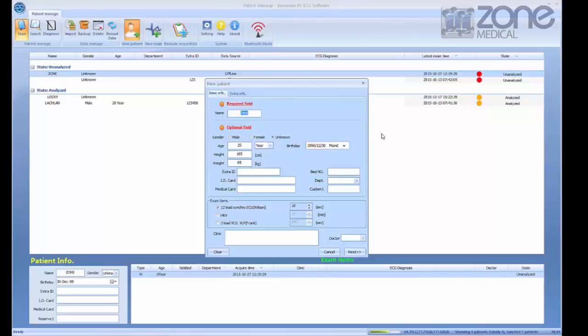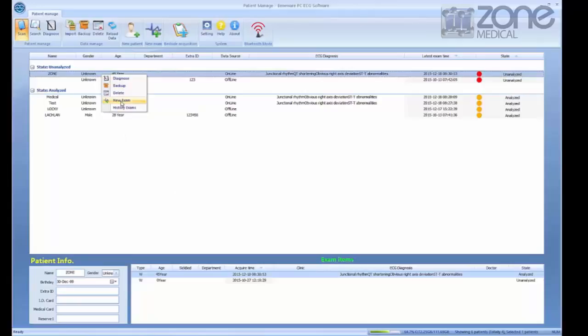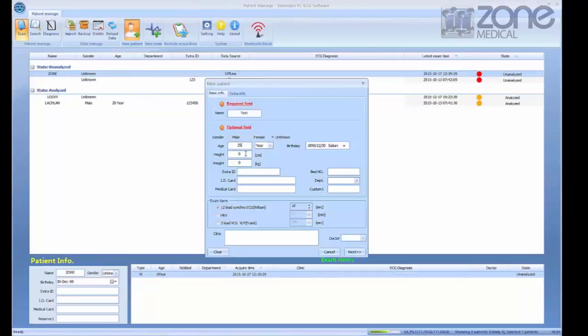You can also run a test from an existing patient on the software homepage by right-clicking on the patient name and clicking new exam. Then you can change any relevant details since their last test.